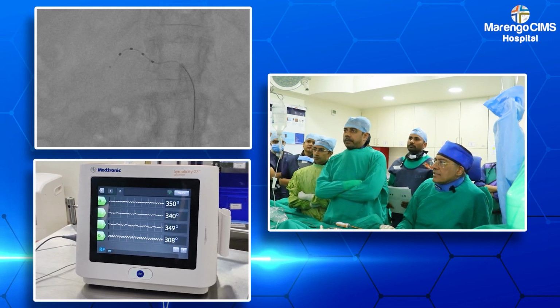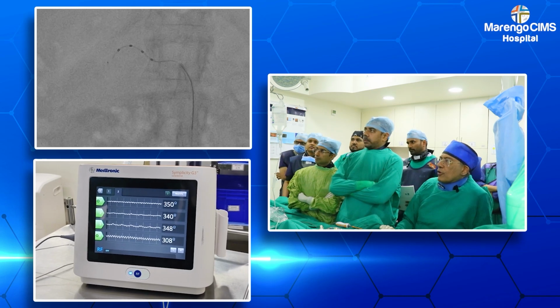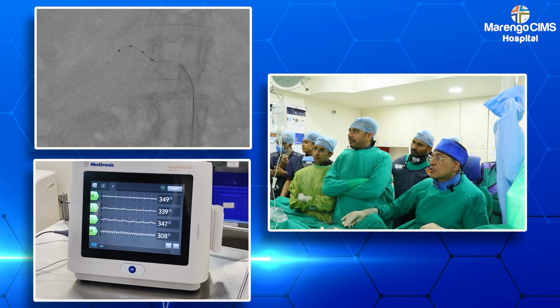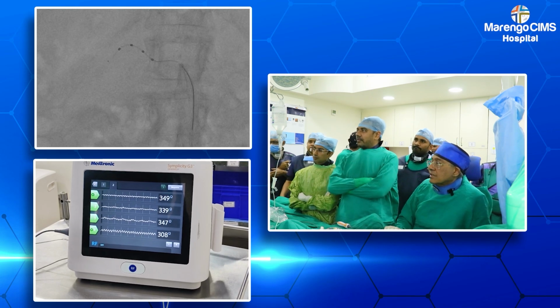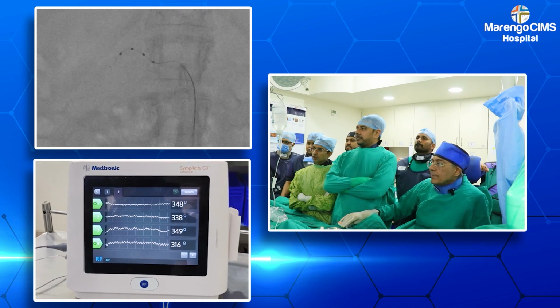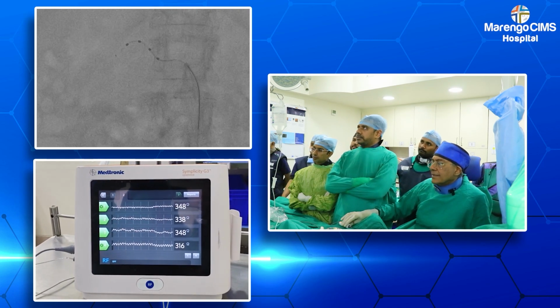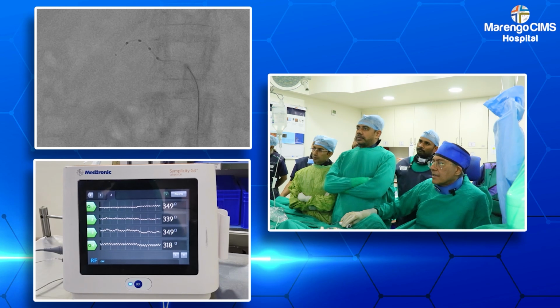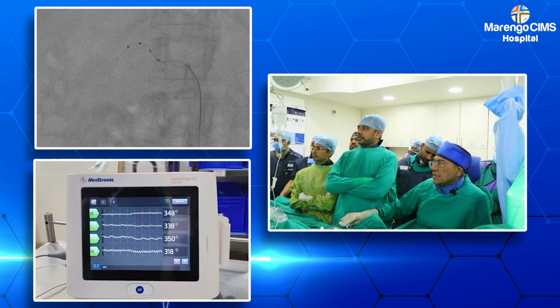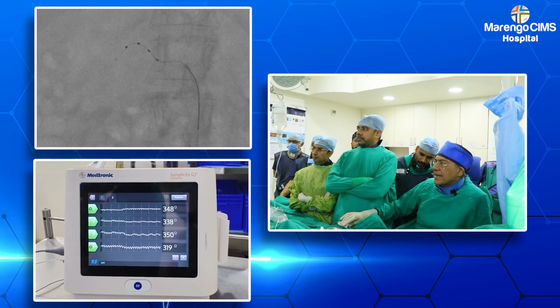This time, as you see on the screen, the impedance of all 4 electrodes is within adequate limit. When we had positioned, the most proximal had an impedance which was slightly on the lower side. So I did rotate the handle with my arm, and the impedance which was around 305 ohms has gone up to 320 range, which is reasonably adequate.